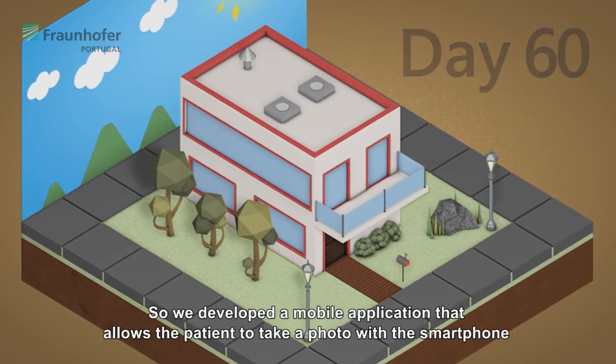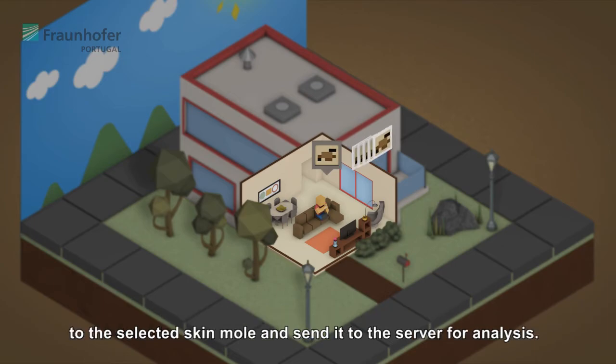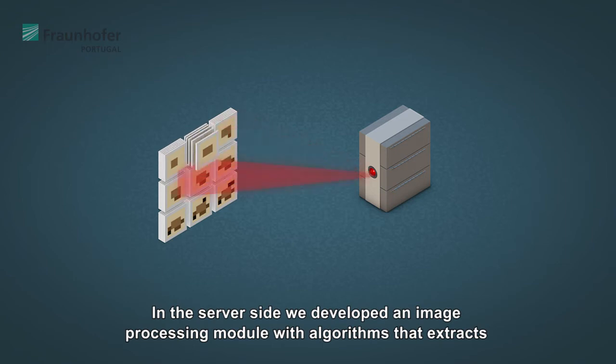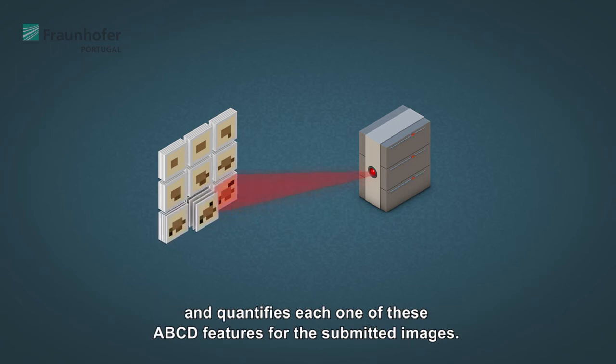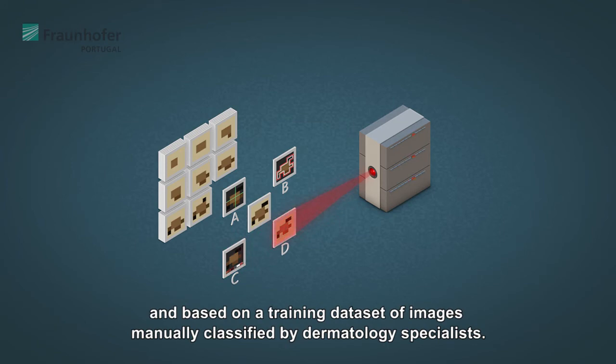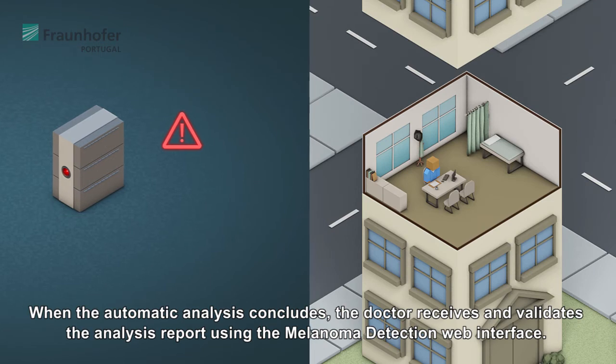moles. So we developed a mobile application that allows the patient to take a photo with a smartphone of the selected skin mole and send it to the server for analysis. On the server side, we developed an image processing module with algorithms that extract and quantify each one of these ABCD features for the submitted images. The classification of each feature is made separately and based on a training dataset of images manually classified by dermatology specialists. When the automatic analysis concludes, the doctor receives and validates the analysis report using the Melanoma Detection web interface.